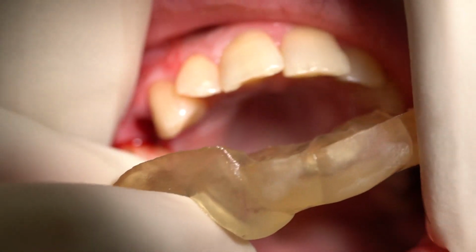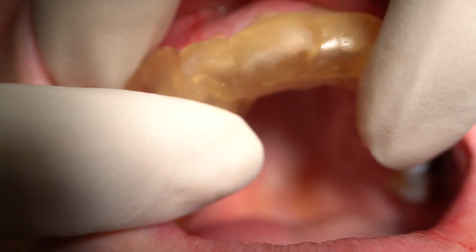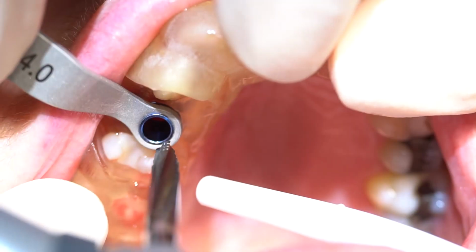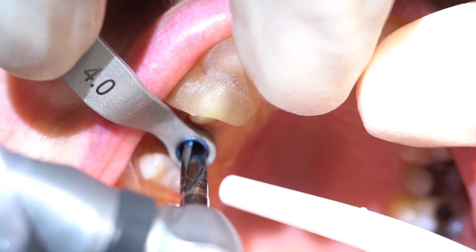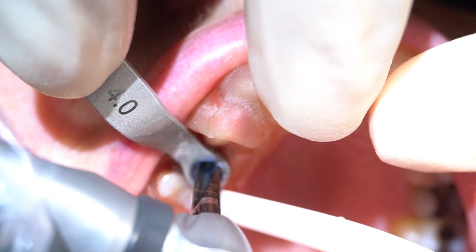So this is a surgical guide. This is what it looks like. And what it is, if you imagine this pen is the drill that we're going to use. The surgical guide has a hole in it, which is the perfect size for this drill. And this drill's got little markers to tell us the depth, which means that when the drill is placed, the hole is in exactly the right position. And therefore our implant is going to be in exactly the right position. Or so the theory goes.